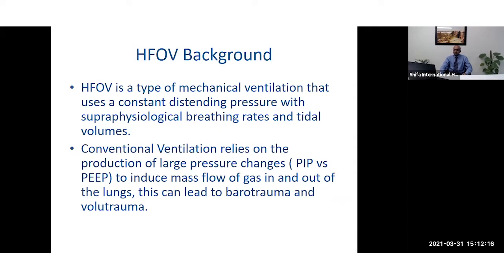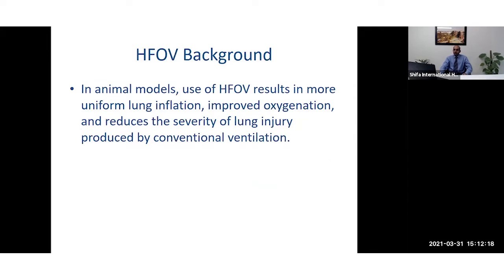But in animal models, we have seen that the use of high frequency, so small volumes at a very high rate, leads to more uniform lung inflation, improved oxygenation, and that reduces the severity of lung injury compared to conventional ventilation.